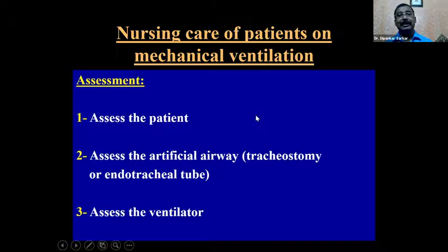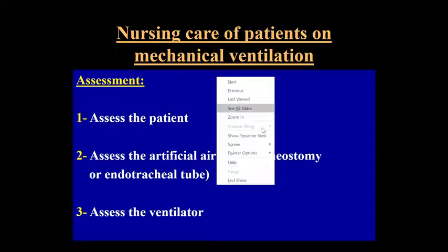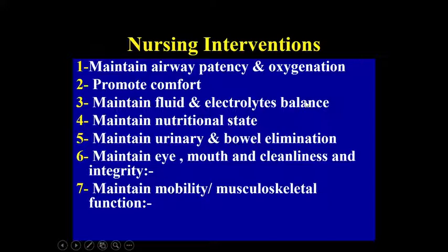And for practical purposes, all ventilator machines should have a bain circuit by the side. Because a ventilator ventilates a patient in what we call, in anesthesia, a type D circuit. Your Ambu bag is basically a type A, and the Bain circuit is basically a type D anesthetic circuit. So anesthesia people will know this better. This is just for theoretical jargon. If somebody wants to give an MCQ on this, they're welcome.